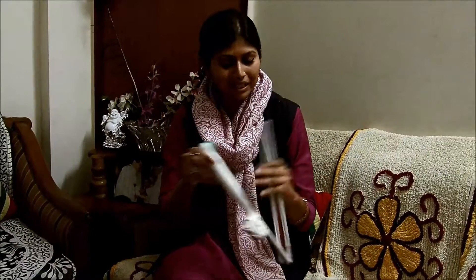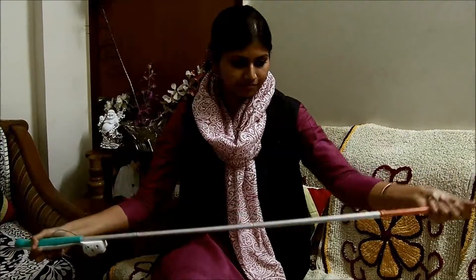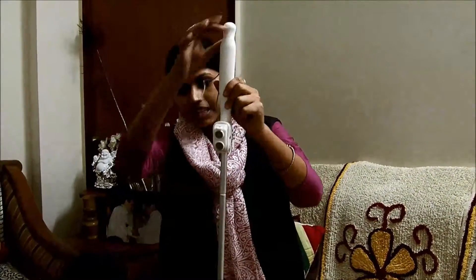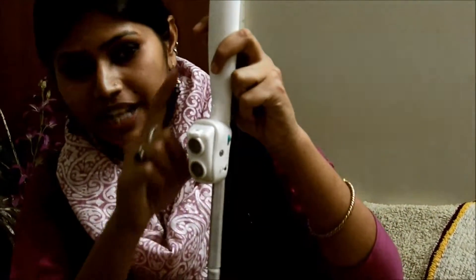Now let's learn about the basic operation of this device. This is the grip of the device, and this is the sensor box which contains two sensors that are responsible for detection.